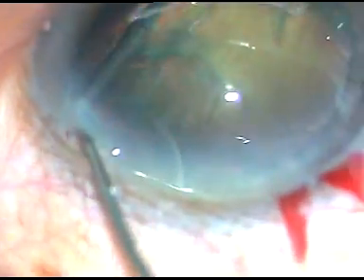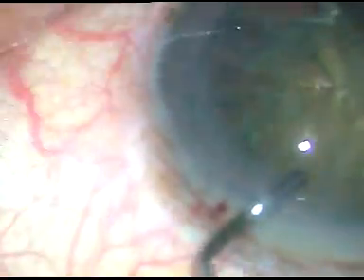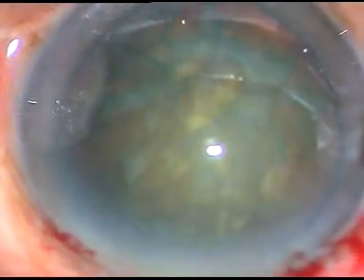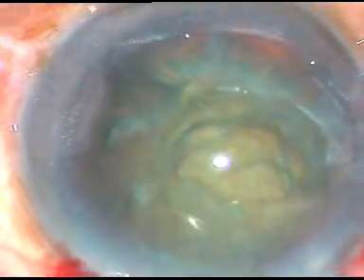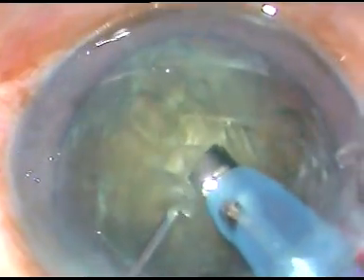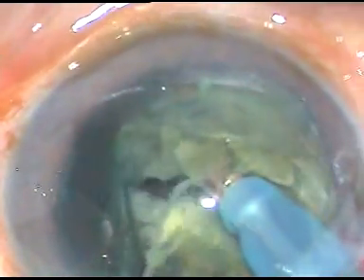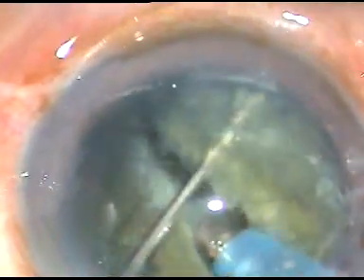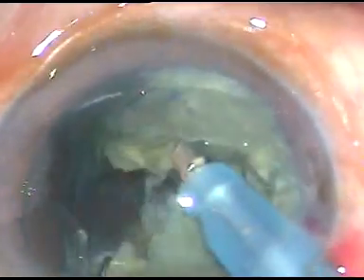Hydrodissection and nuclear rotation is done. And now I inject a bit of viscoelastic substance in the anterior chamber and then start phacoemulsification. So I usually do this direct chop: bury the tip in the substance of the nucleus and then chop it into fragments. This is Alcon Centurion phacoemulsification.